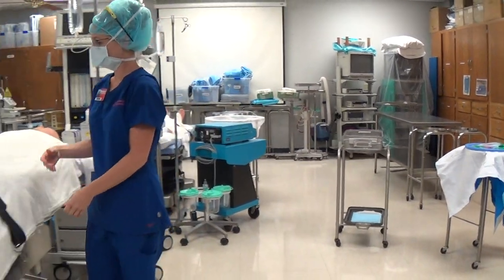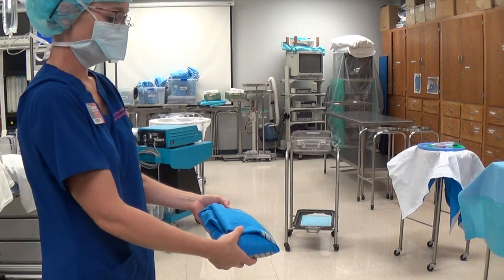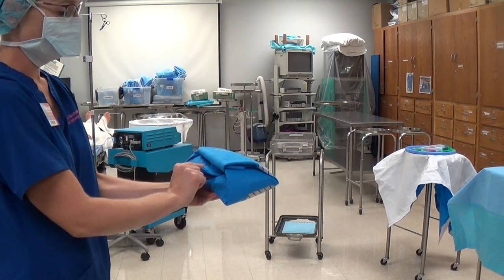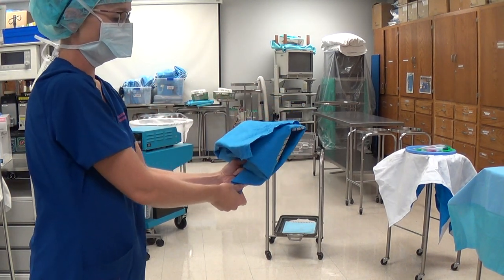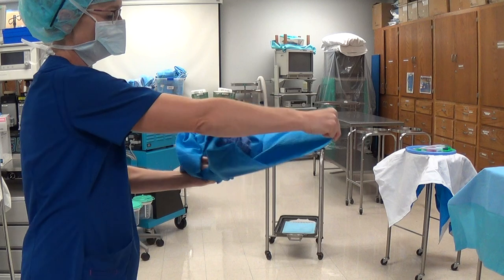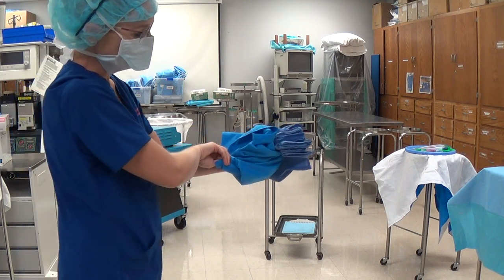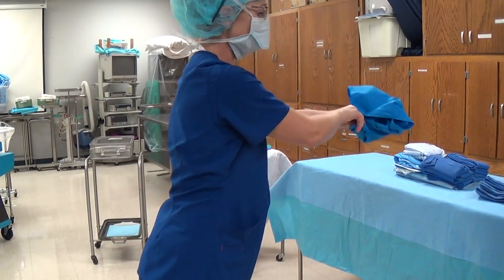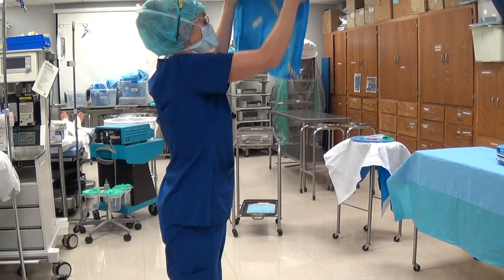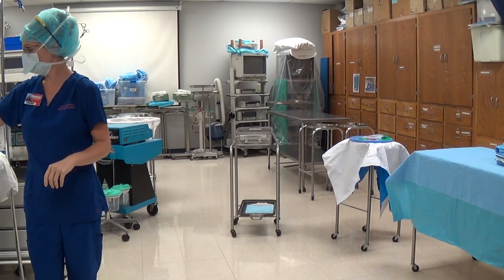Once she's done with that, you have your gloves you need to open, your towels, and a suture. I don't care what order you do them in. Casey's grabbed her towels. Sticking your finger underneath that first flap, the corner's sticking out at you, so the first flap is opening away from you. Without going over the open edge of the wrapper, she's going to flap her corners around and make sure she's tucking those corners into her palm so they're not loose when she's throwing it. Grabbing that last edge, making sure all of her corners are secure, and throwing it onto the back table without going over the sterile field. Backing away without putting her back to the sterile field, and checking her wrapper for holes. If there were holes in the towel wrapper, you would just get a whole new back table.